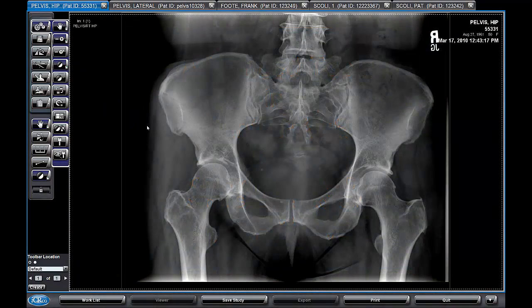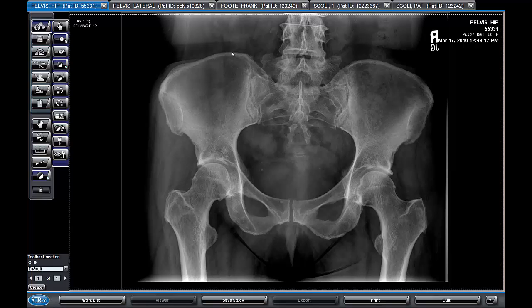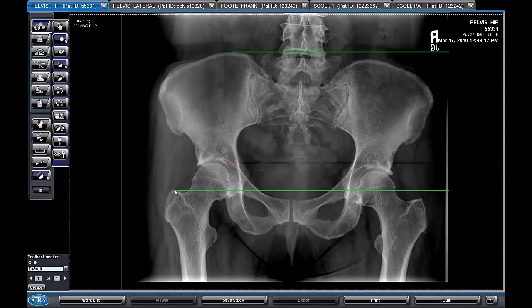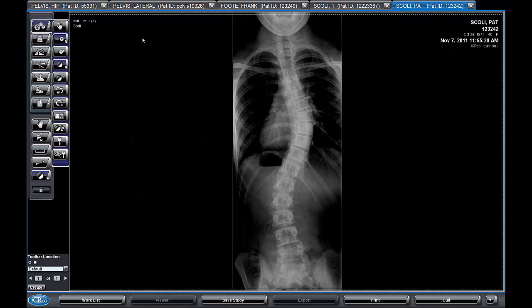The advanced tools can be found in the upper left-hand corner of any image. Starting with the horizontal tool — we use this by a single click to drop the horizontal line, and that draws to the opposite side of the screen. We can move this around and change the length, but it stays horizontal. We can do the same with the vertical line tool.